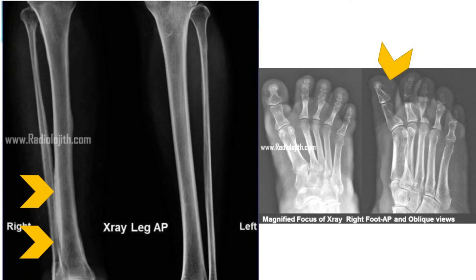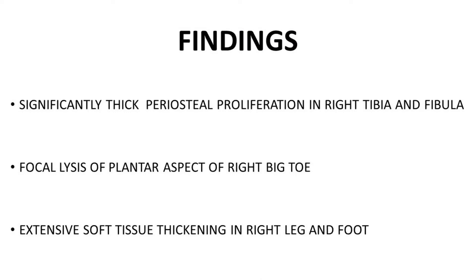In the magnified view, the right foot reveals well-defined focal lysis of the plantar aspect of the big toe and of the medial aspect of the second metatarsal bone near the tarsal aspect. In addition, extensive soft tissue thickening is present in the right leg and foot, and the joints appear well preserved.